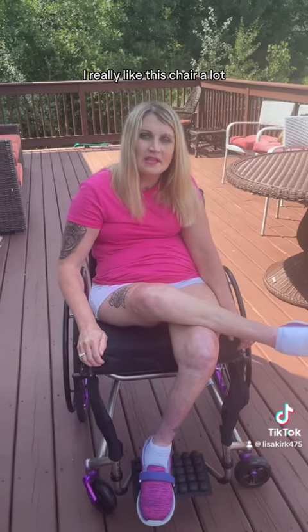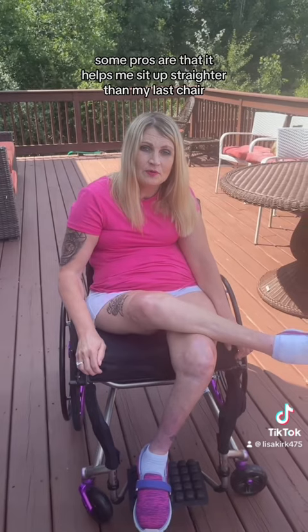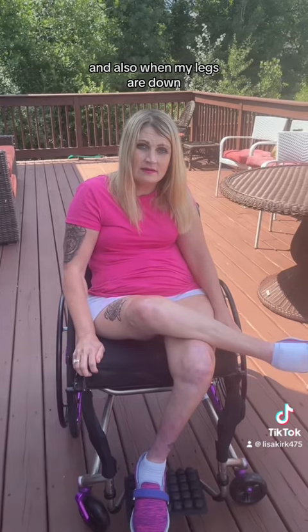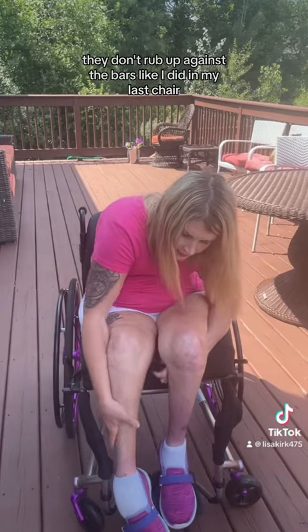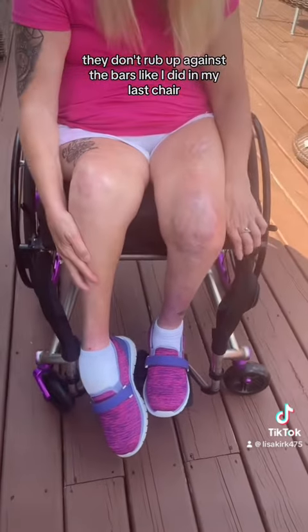I really like this chair a lot. I would give it a great rating because some pros are that it helps me sit up straighter than my last chair. And also, when my legs are down, they don't rub up against the bars like they did in my last chair.